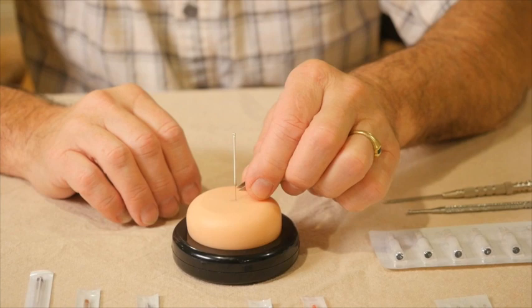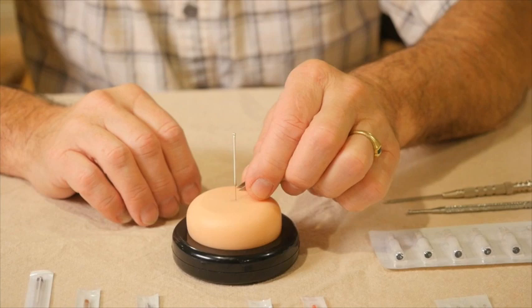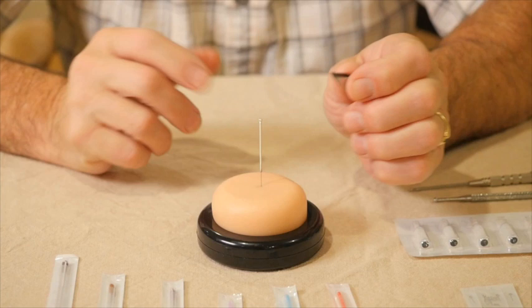If there was a problem — for instance, if a handle came off a needle, which would be very unusual but is a possibility, or if a needle broke and we needed to grab it with forceps — we need to have some of that needle showing above the skin.